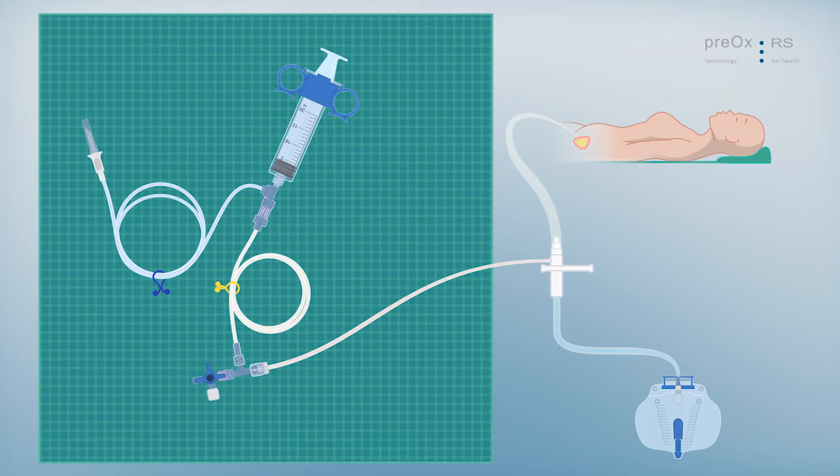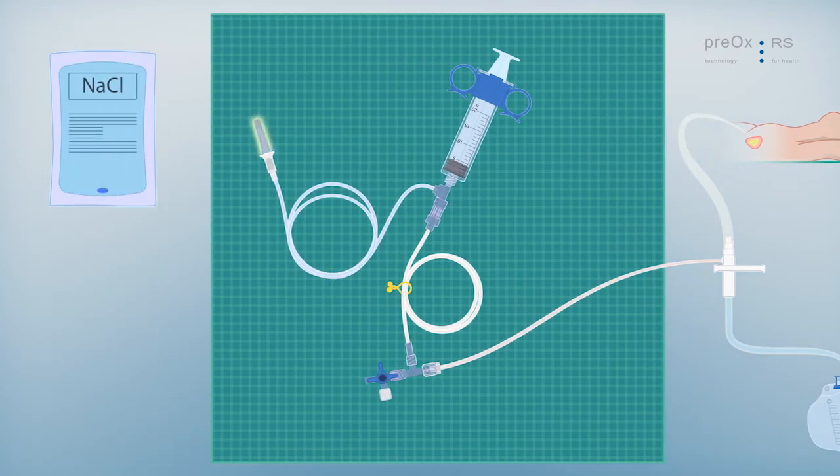Remove the blue clip. Subtract the cap from the spike and prick in the saline bag.